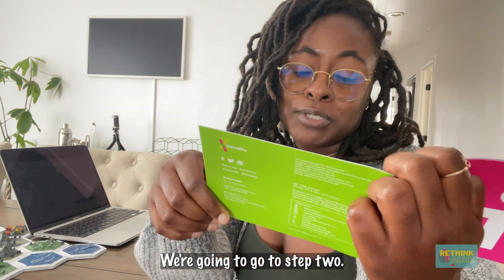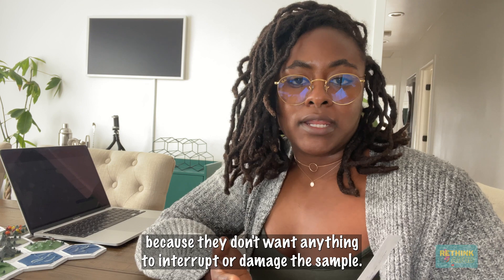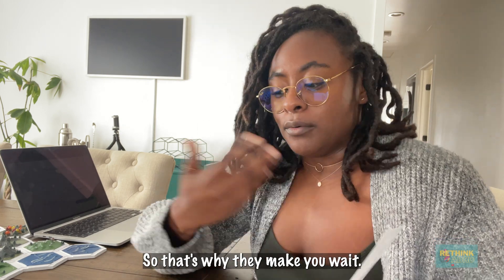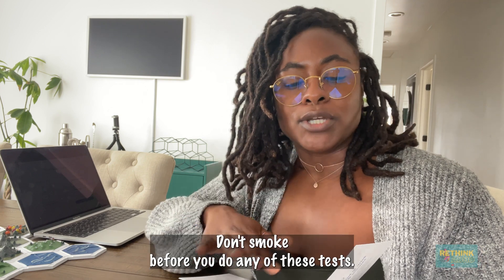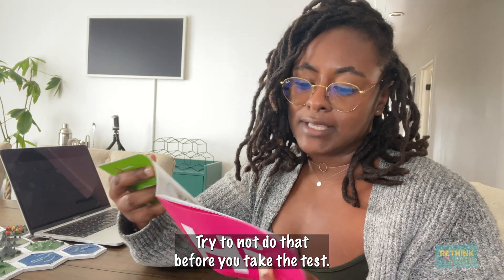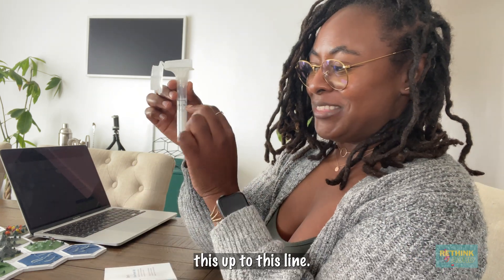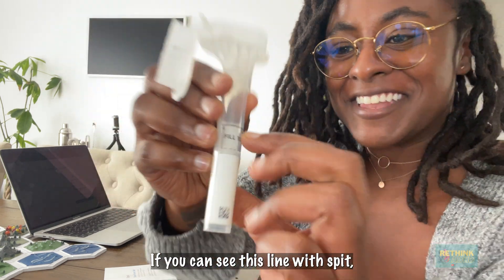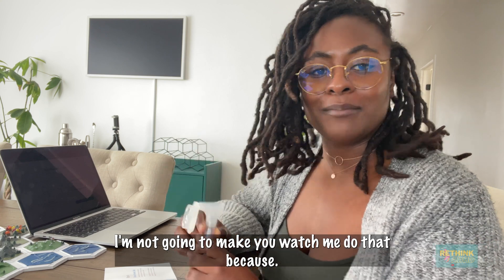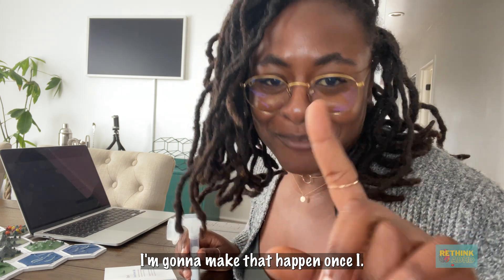Step two is no food or drink for 30 minutes. I haven't eaten or drank anything in that time frame. They recommend that because they don't want anything to interrupt or damage the sample. Same thing applies for smoking — don't smoke before you do any of these tests. Some people say 30 minutes; I'd say an hour. Step three is to fill this up to this line with spit. Give me a minute — I'm going to make that happen. We made it.